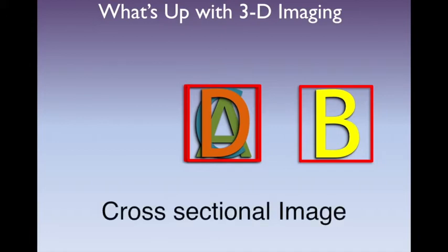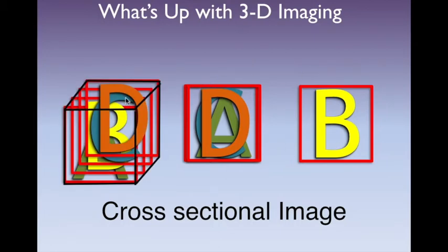cross-sectional image. One of the biggest difficulties in interpretation, and the big difference between interpreting our old two-dimensional picture and 3D images, is that what we see in 3D imaging are cross-sectional images, a clear cut of a picture coming from a three-dimensional object.